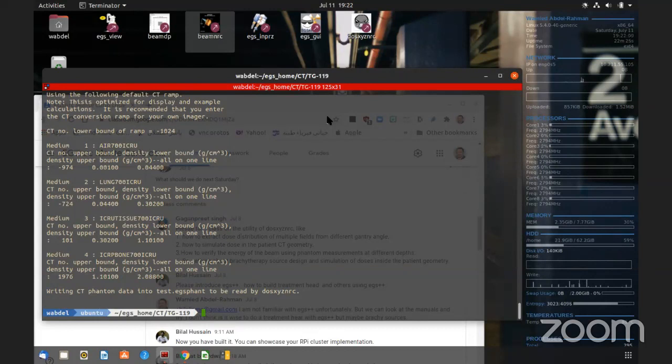Because the CT phantom, when you scan that phantom, you have one CT number for that material. But now we have to say, okay, we need to make a range for it. Okay, so I hope you understand this point. That's why it's left up to you as a user to determine, for example, what is the range of using that particular material.